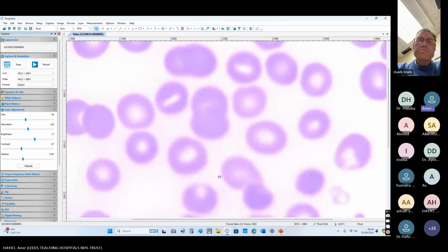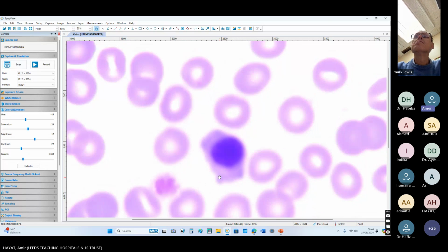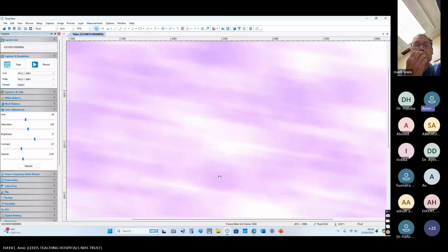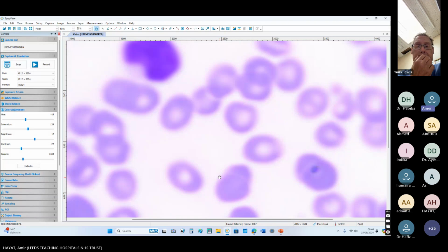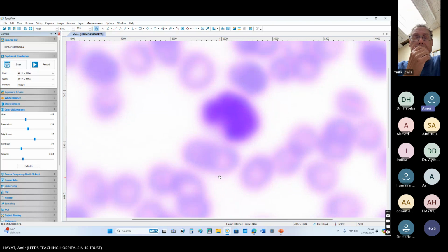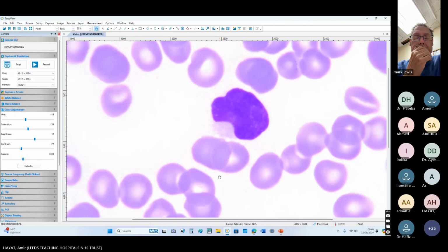Right. So you have commented on the blood film, and you have suggested flow cytometry on the blood and bone marrow biopsy for this patient to confirm your diagnosis. Right. So the next question would be, what is the minimum genetic test requirement for any acute leukemia according to WHO 2022? Like you have done a bone marrow biopsy for a patient, what genetic tests would you like to see in any leukemia patient?